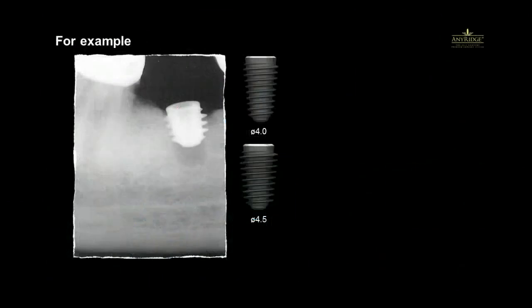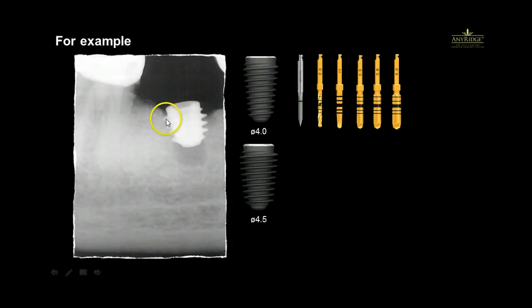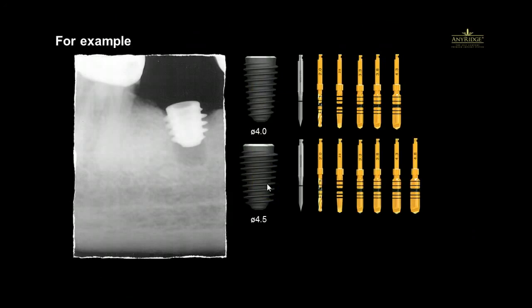So now that we know that, let's go back to the stuck implant. As we see here, where is it stuck? This drilling sequence for your 4.0 and 4.5, taking everything we just talked about into consideration as a final diameter: your 4.0 is really a 4.4 at your widest diameter, which is here. Your 4.5 is really a 4.9 at your widest diameter here. So here it's showing you the sequence of 2.0, 2.9, 3.3, 3.8, 4.3, and 4.8 for your final drill diameter. However, again, do you want to always do that?